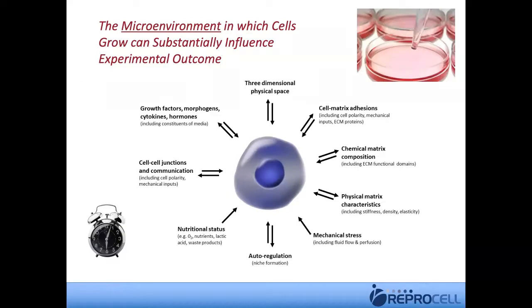So the microenvironment in which cells grow in the lab can substantially influence cellular behavior. The point of this slide is to show you how a cell, as depicted in the center, can be responsive to all those different factors, which we can also control in that microenvironment.